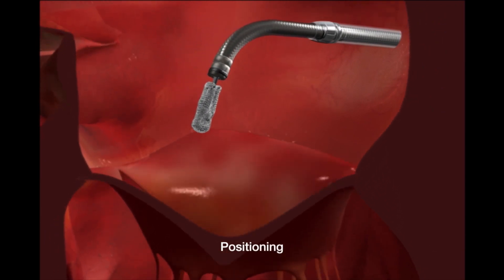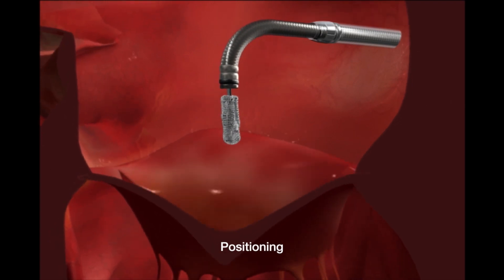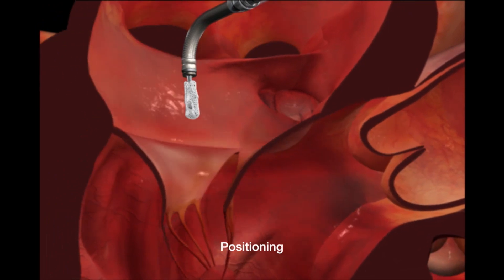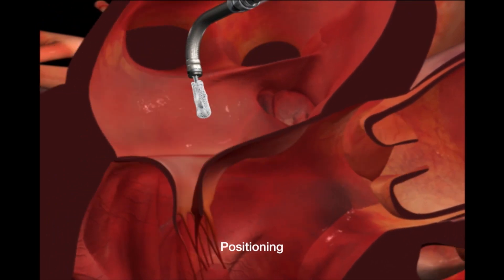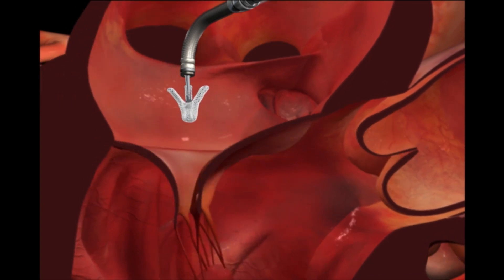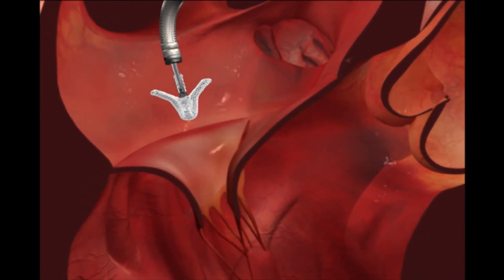The clip is precisely positioned above the leak in the valve. The clip arms are opened in the left atrium for final positioning.